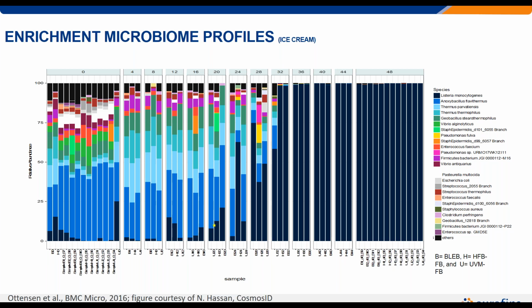So I'll describe quickly here. We talked about rapid methods being needed in produce testing, and that's because we just honestly don't have much of the luxury of time. Unfortunately, time is what allows us to grow up our target so that we can find it in that enrichment, so that one cell in 375 grams, say.